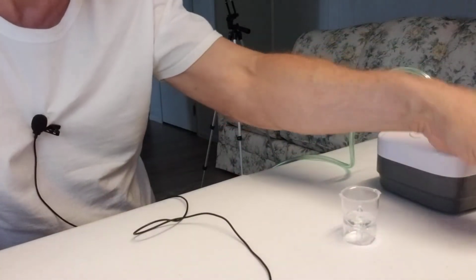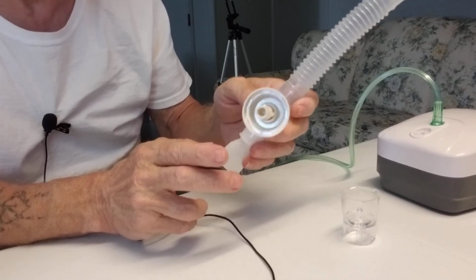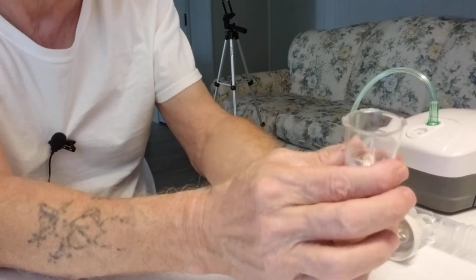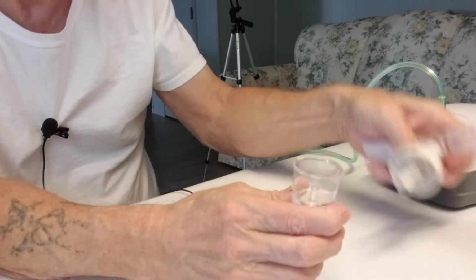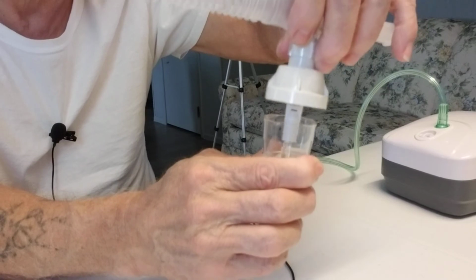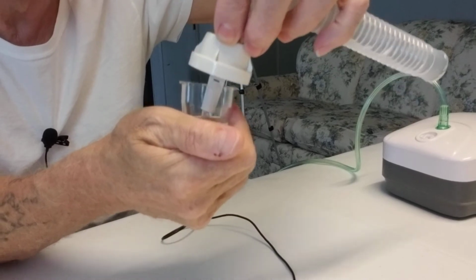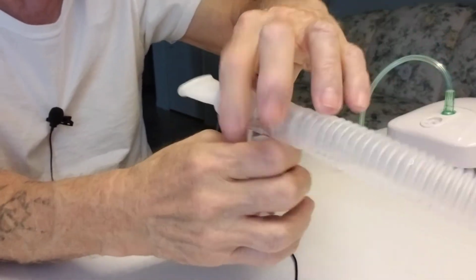Now that your container is completed, you have an opening on the bottom of this connection, which connects to this little piece right here. I don't know if you can see that very well with my hand in the way. There is a metal piece or a plastic piece here. This just slides down over it. It locks into these little lips right here. Slides down over. You simply turn it. Jumps down, locks in, give it a little tug, it's secure.